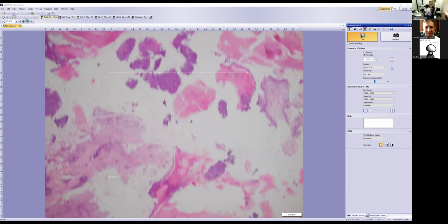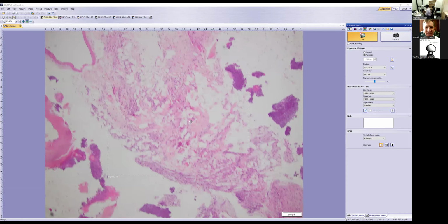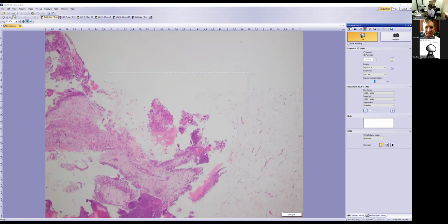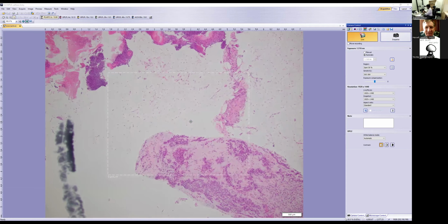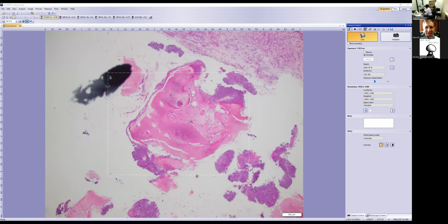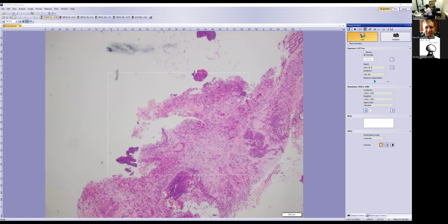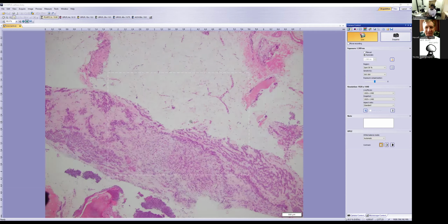And then I asked the radiologist if the patient had any other breast lesions that they could see. They said no, they could not see any breast lesion by ultrasound, and that does not exclude that there's no mass. There might be some non-mass forming enhancements, but because of the pregnancy status, they couldn't do any additional testing. So I ended up signing this out as invasive tumor because of this infiltrative pattern with associated keratinizing squamous fragments.